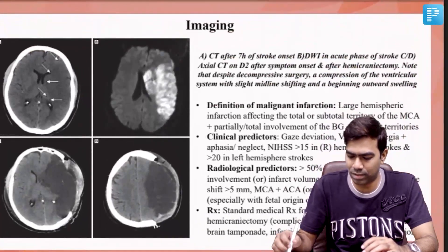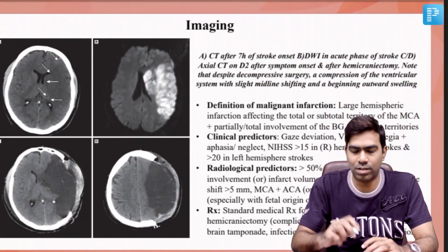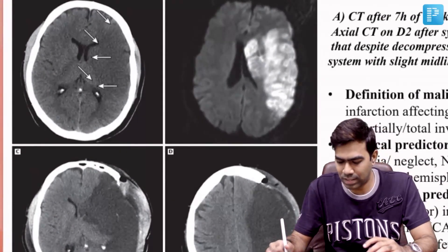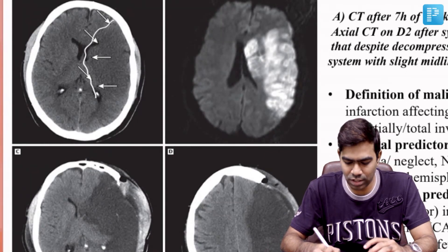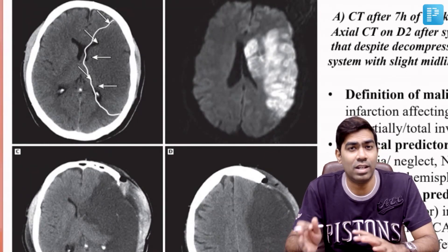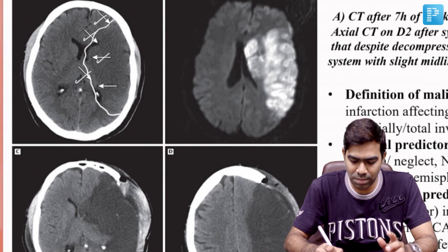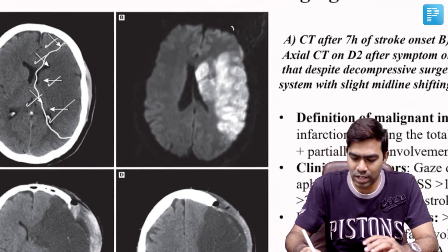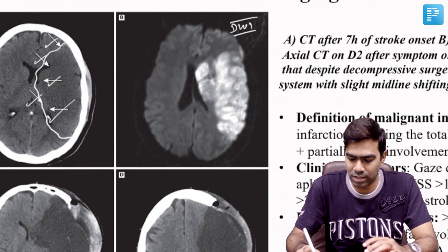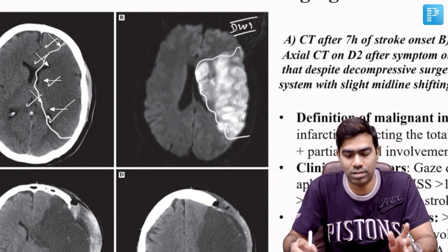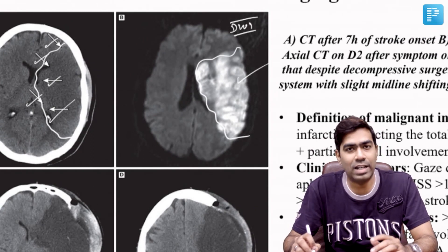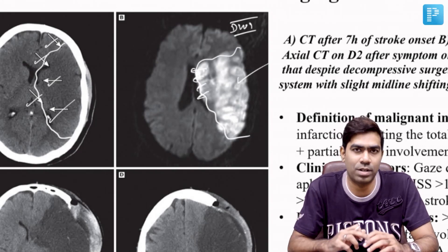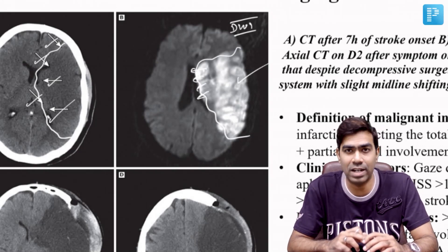This is another example of cerebral edema on imaging. The patient has a definite and huge hypodensity in the left MCA region, with arrows marking the borders of the stroke. The corresponding diffusion-weighted imaging shows how large the stroke is in the MCA region, and even in early stages you can see mass effect in the form of ipsilateral ventricular compression, though no significant midline shift yet.